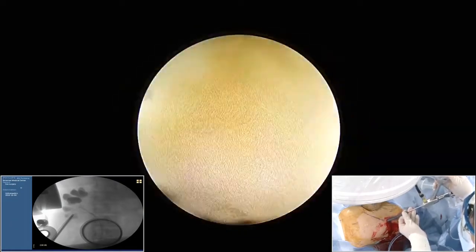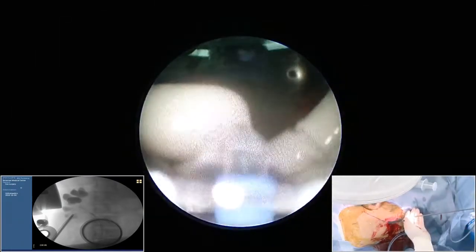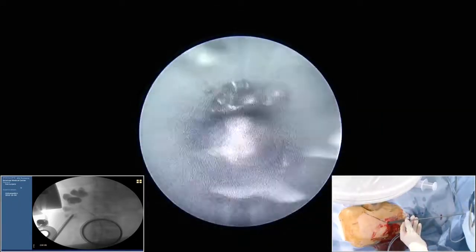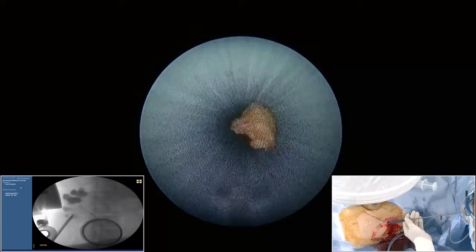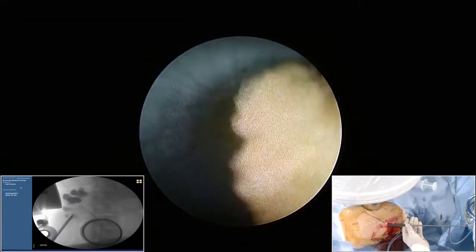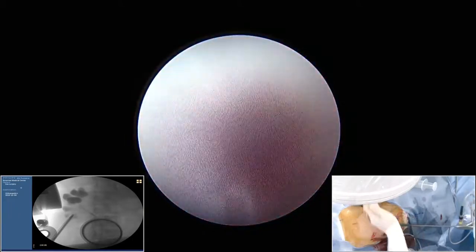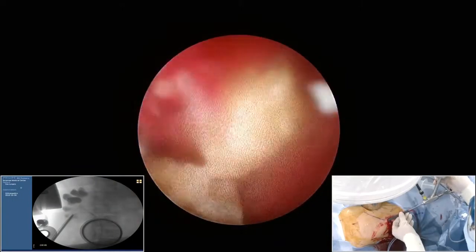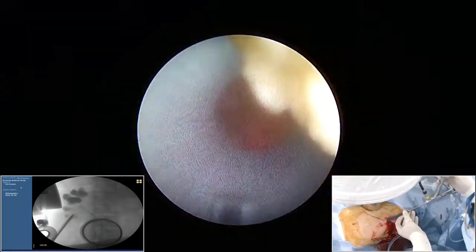And this is the supine position, so I don't need any suction for retrieval of these stones, because stones can come out very easily, spontaneously through this track. We call this the vacuum cleaner effect. And I collect the stones in a bowl on the patient's abdomen like this.